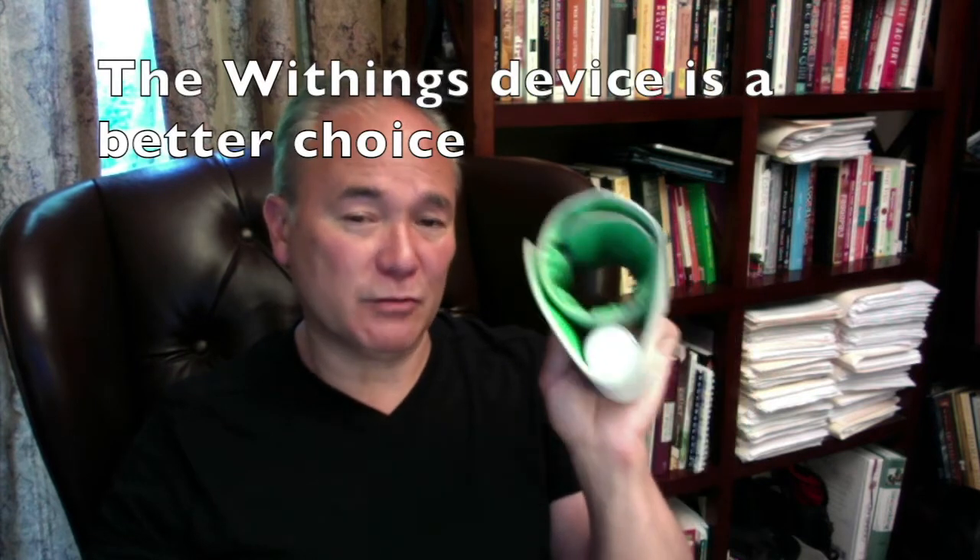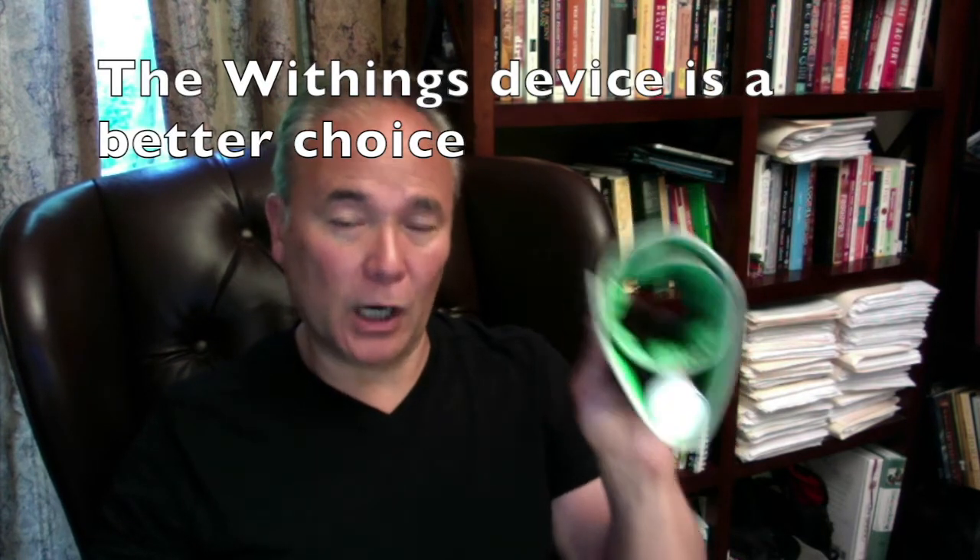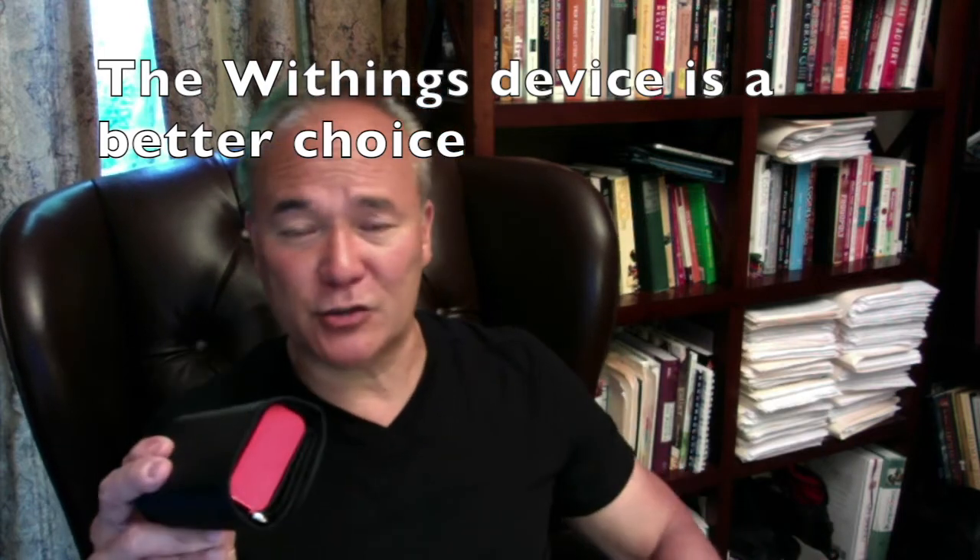If you're not going to use it for travel, it's much easier to use the Withings device — you put it on first try without fail. The Qardio you're going to have to fuss with; if you're not that good with your hands you might even require someone else to help you put it on. Both are $99, so there's no difference in price. Given the same price, I'd go with the Withings device — though if you travel and want something smaller and compact, the Qardio is probably your choice. Both are wonderful, but I think Withings did a better job engineering the cuff itself and the ease of use of the device.